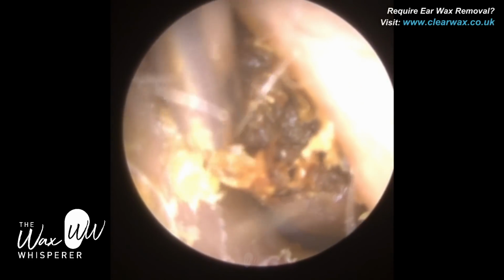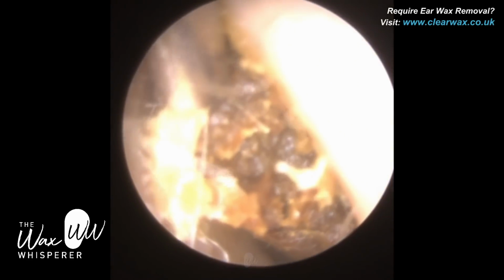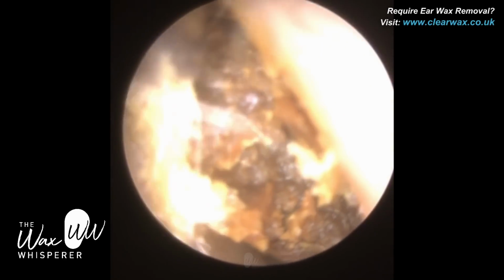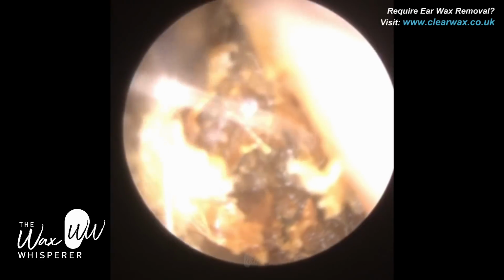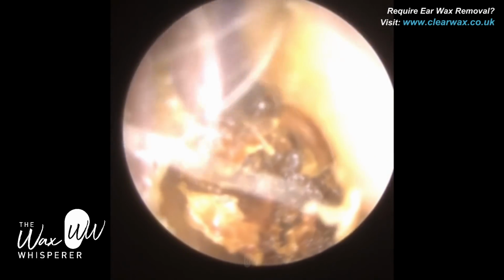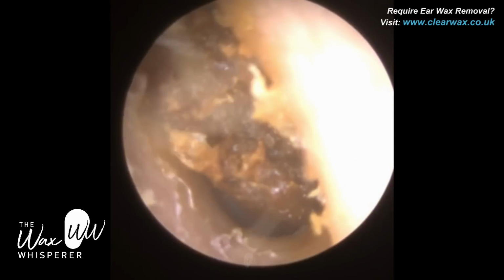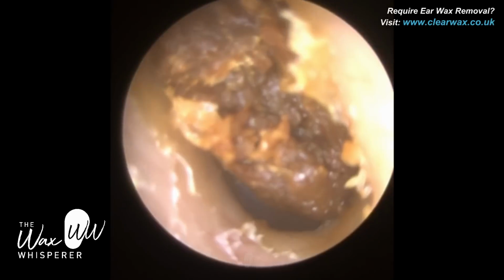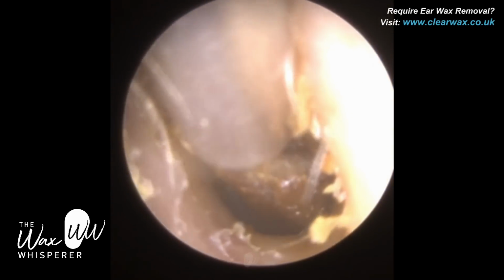Again, some keratin on this is on the posterior canal wall, the back part of the ear canal. And I'm just trying to go to the root, trying to bring this plug of wax down and forward, trying to roll it. Sometimes we can roll it if the wax is quite dry and in pellet form, we can sometimes roll it out. Just see how narrow that is. You can see how elongated it is.